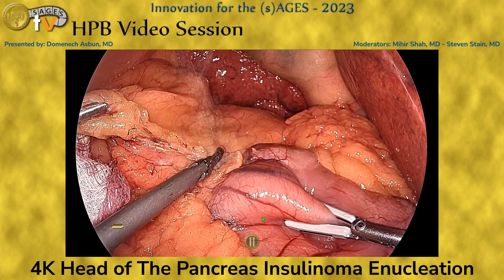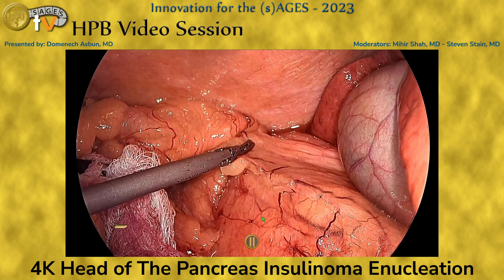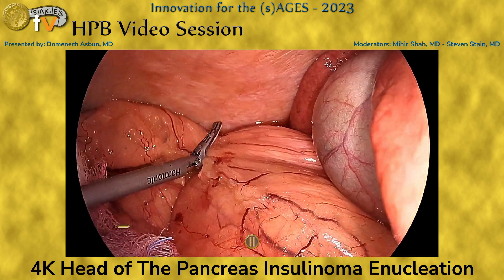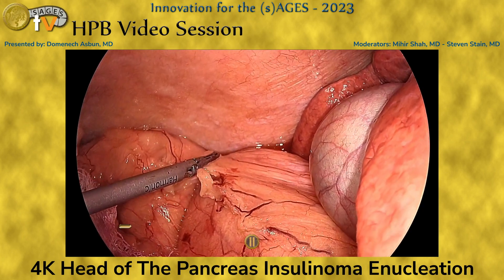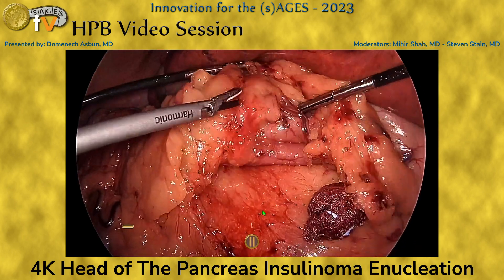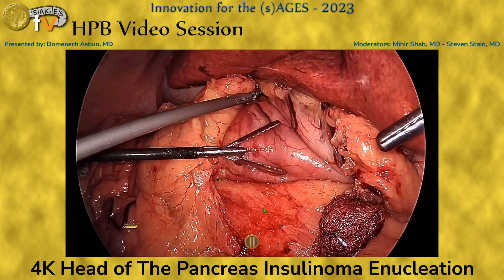We start off by entering the lesser sac through the gastrocolic ligament. We mobilize the transverse colon, just as we would for a Whipple, and up to the hepatic flexure, separating the mesocolon from the retroperitoneum, gaining better access to the area anterior to the pancreas.